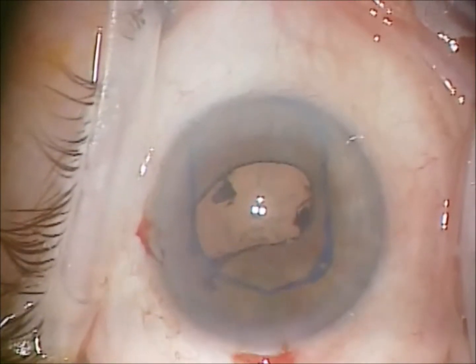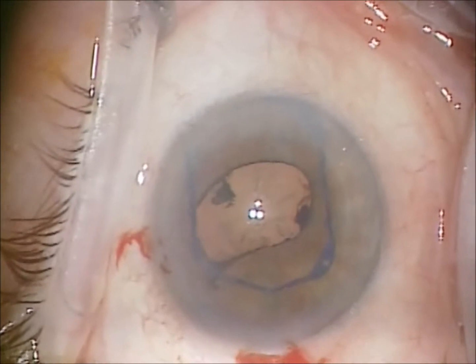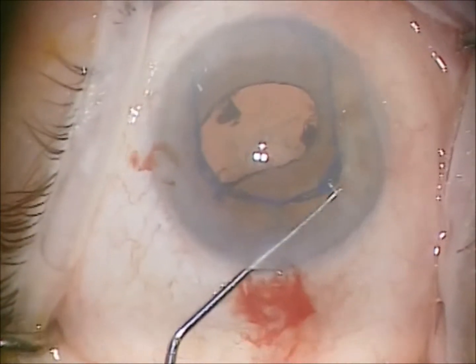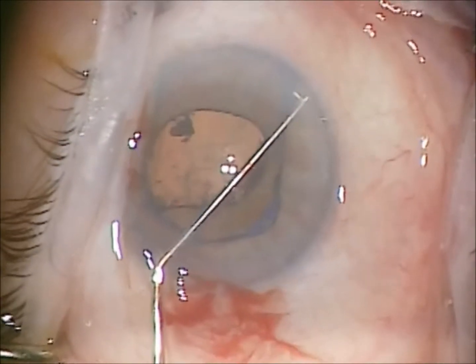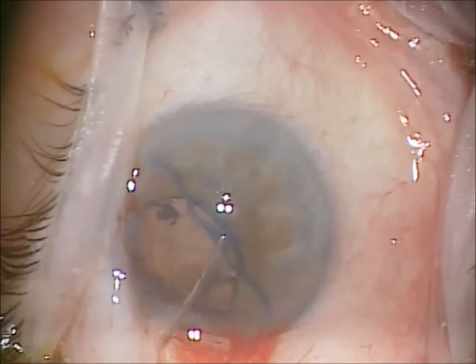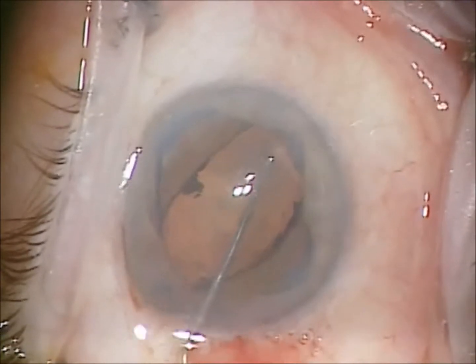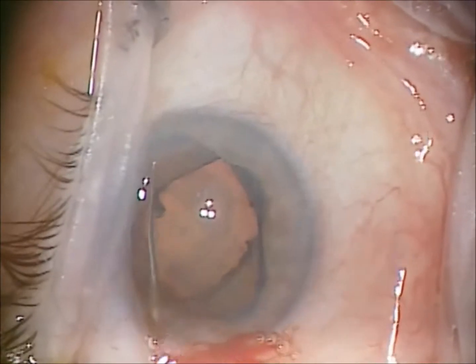More viscoelastic is instilled to give us a little more room here. The placement device, which is similar to the end of a Sinski, is used to place each corner of the expander over the pupillary margin. Kind of holds it like a little U-shaped envelope.